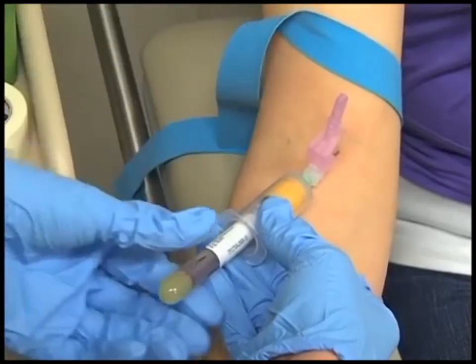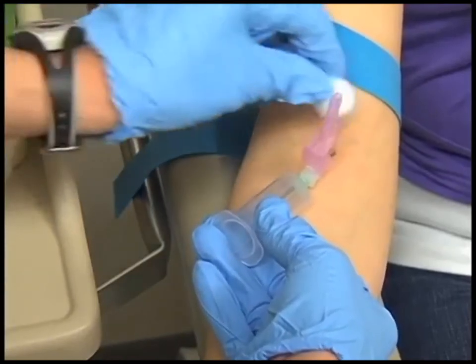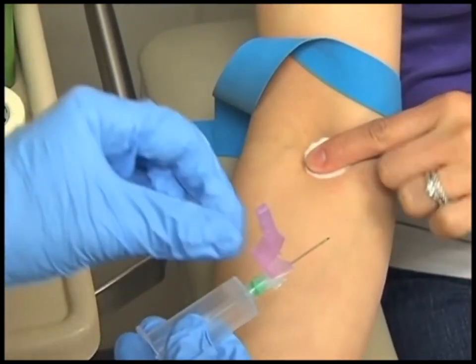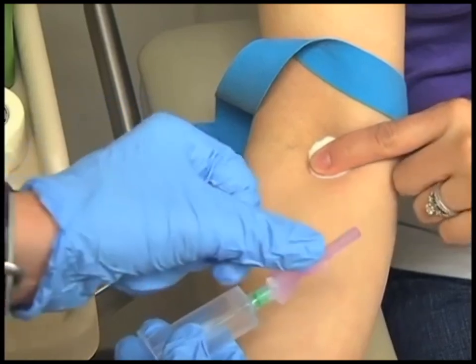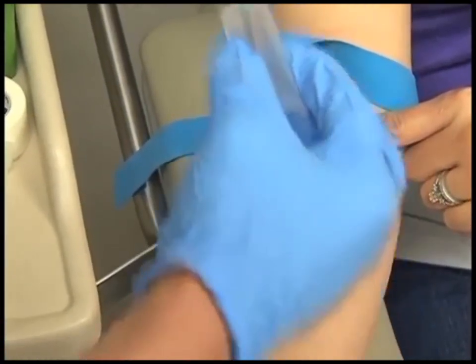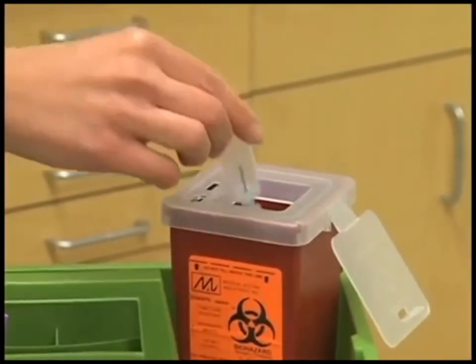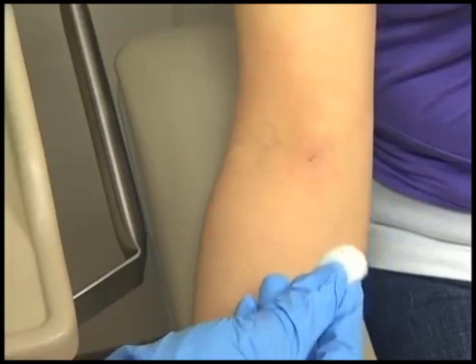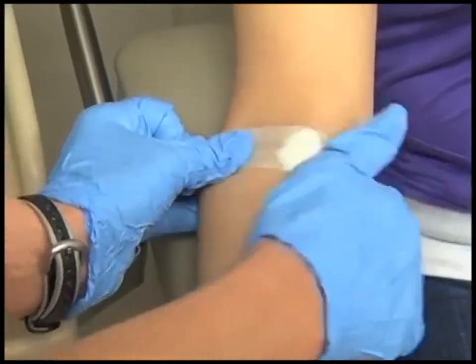Stabilize the vacuum tube setup by firmly grasping the holder between the thumb and underlying fingers to prevent the needle from moving. Place a cotton ball slightly above the puncture site and carefully withdraw the needle at the same angle as penetration. Immediately move the cotton ball over the puncture site and apply firm pressure. To activate the safety, push the shield forward with your thumb until you hear an audible click indicating the shield has been locked into place. Immediately discard the plastic holder and attached needle in a biohazard sharps container. Ask cooperative patients to apply pressure with a cotton ball for one to two minutes, then remove the cotton ball and inspect the puncture site to ensure the opening is sealed with a clot. Apply an adhesive bandage to the puncture site.